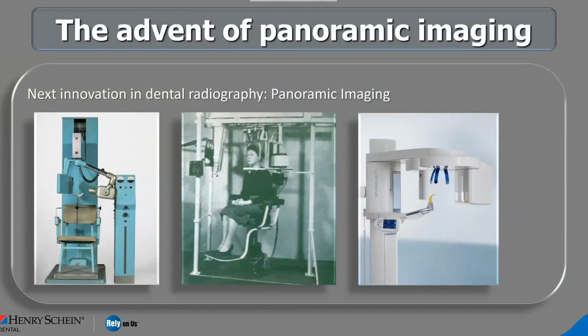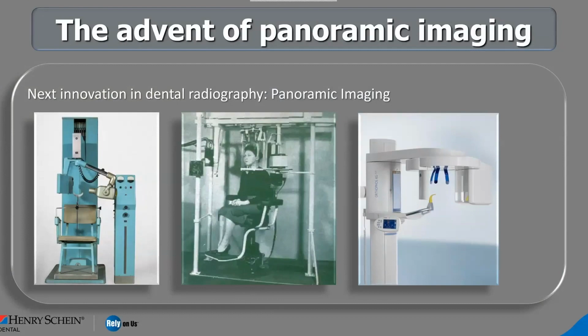And those early panoramic units, the x-ray unit was stationary and the patient spun around. So you want to talk about motion artifacts and patients getting sick in your chair, definitely was a problem in those days.